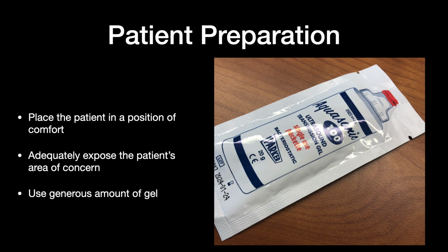So don't be stingy with your gel. Gel is decently cheap. Apply as much as you need, apply a little bit more than you need, and just glide that transducer through that gel pile so you aren't putting a significant amount of pressure on your patient's skin.